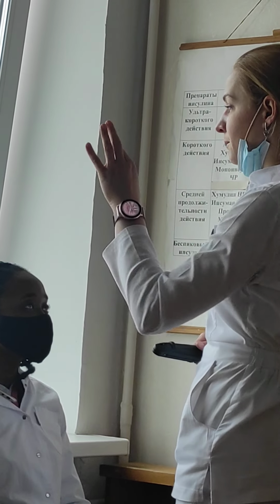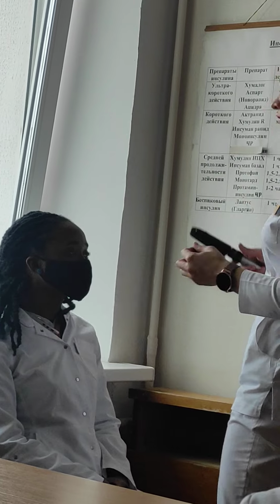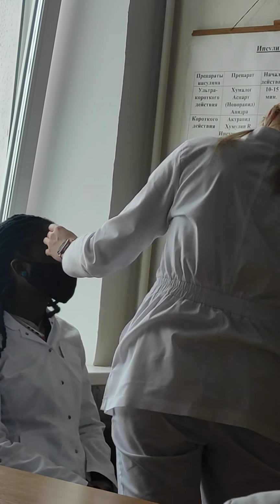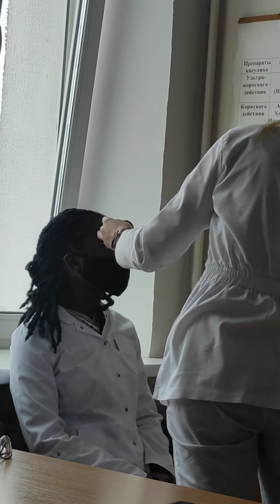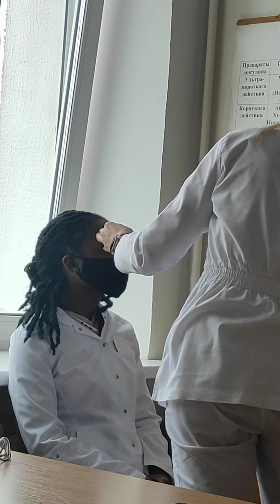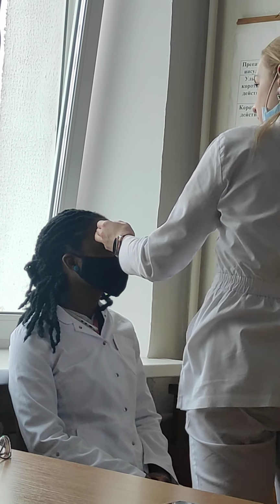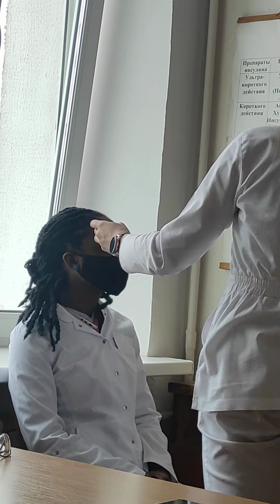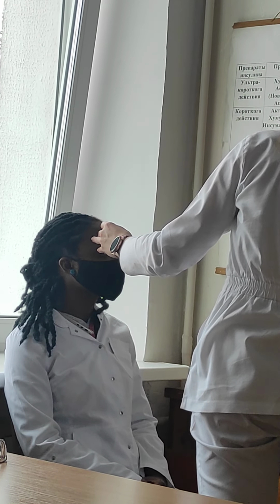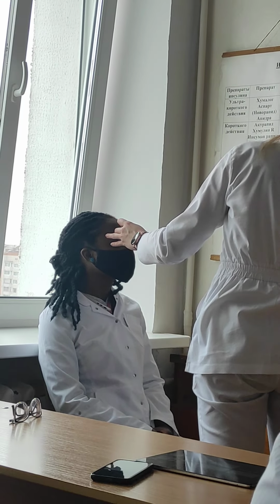After that we need to check the periphery of the retina, and to see that we ask the patient to look in different directions. First, the patient is looking up. Look up, please. And we do the same: see the reflection, and after that put the lens and try to focus the picture. After we take a look at the lower part of the retina, we ask the patient to look to the right, then down, repeating the same stages once again, and to the left.